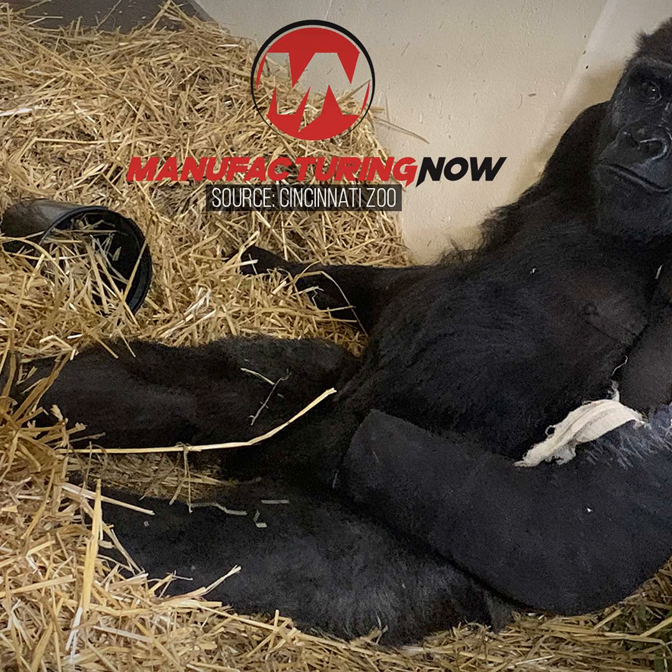A traditional cast with an outer layer made from plaster or fiberglass is more than sufficient for a human with a broken bone. But for a gorilla, which is about 10 times stronger than a human being and less likely to put up with some discomfort, that type of cast doesn't stand a chance.